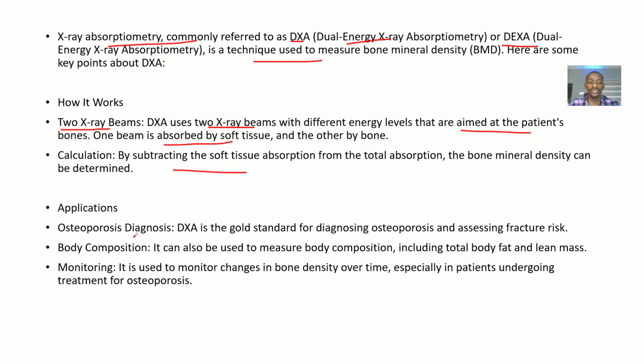Application: you use it in diagnosing conditions that affect bone density, like osteoporosis. This Dual-Energy X-ray Absorptiometry is a gold standard for diagnosing osteoporosis, and also assessing the likelihood of that patient incurring a fracture.